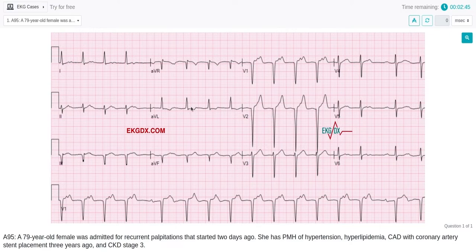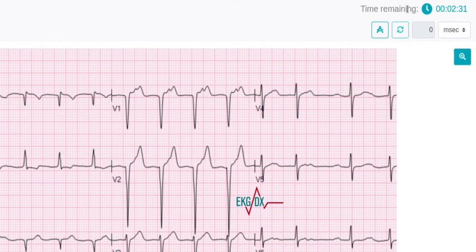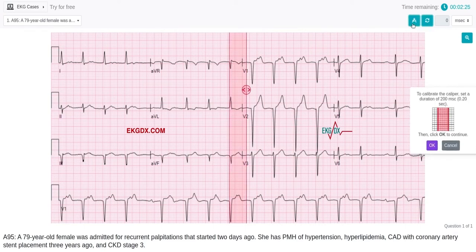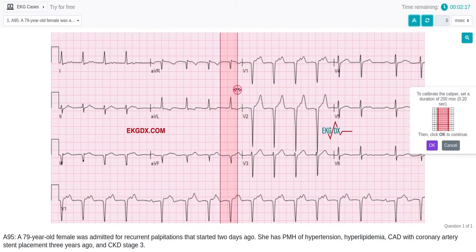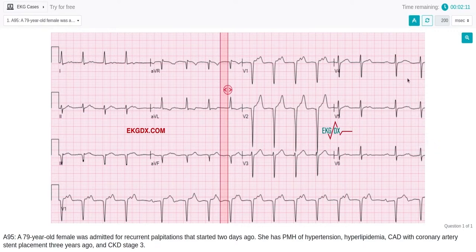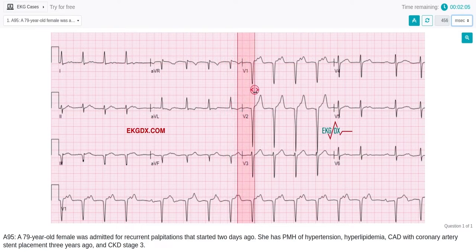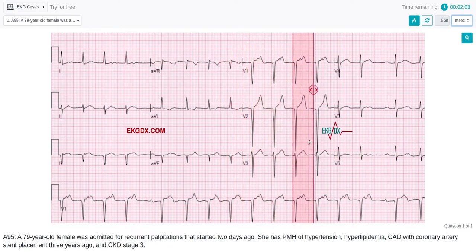Each case study is presented in the standard 12-lead EKG. In the upper right corner, you will find the caliper, the time meter, and the zoom. To use the caliper, you must first calibrate it. Just follow the instructions that appear on the right — it's very easy. Using the mouse, set the caliper to 200 milliseconds, a big square, and then press the OK button. Put the mouse over the pink bar, and holding the left click pressed, you can move it from one side to another.